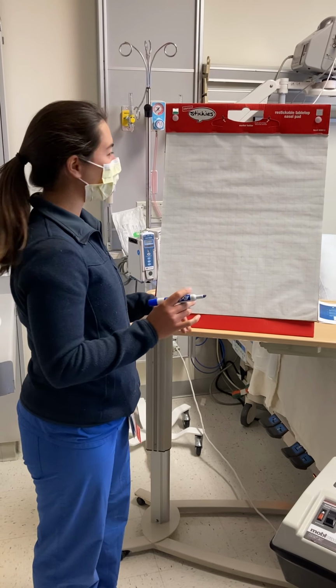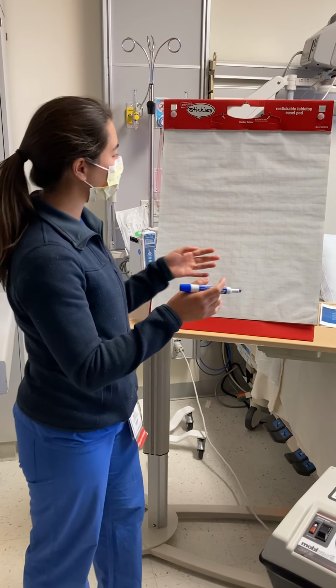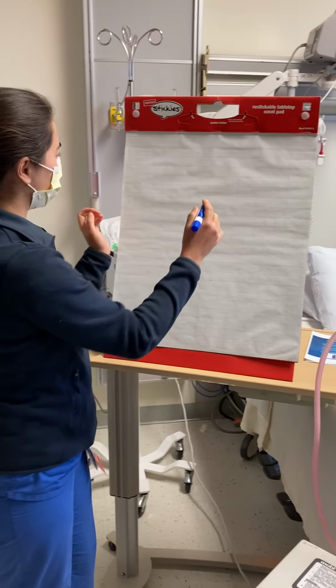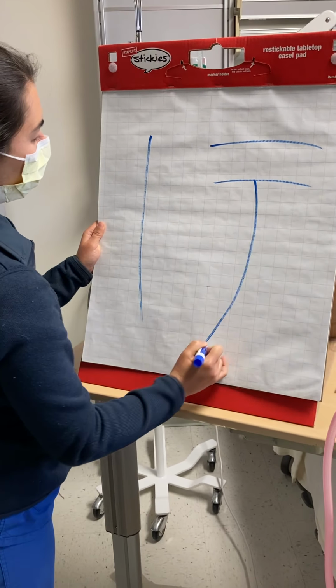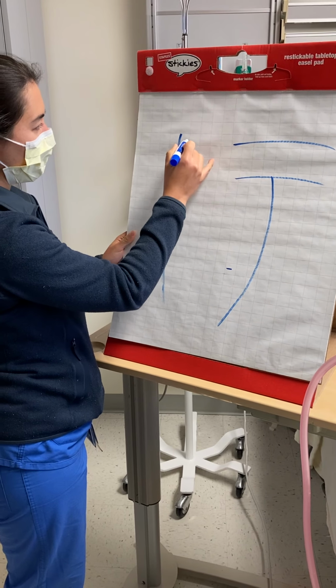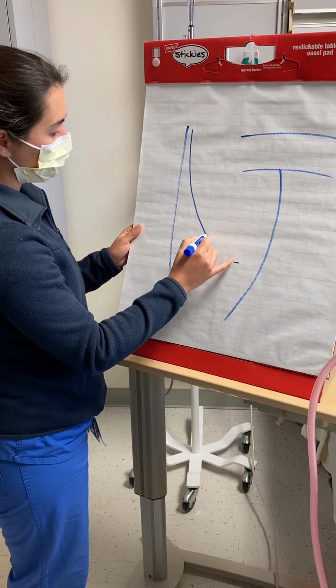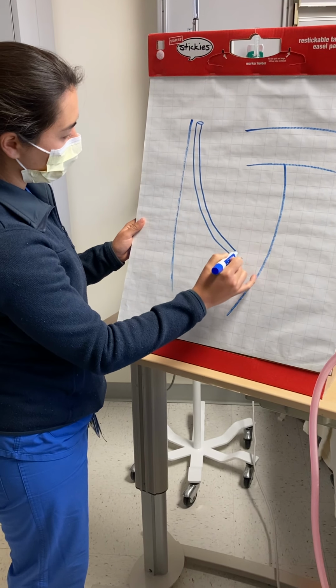All right, so we're going to talk about how to assess the atrium and the chest tube, but first I want to start off showing you where it normally lies. So if you imagine a patient's laying on their side like this, and then here's the arm. Normally you'll see a chest tube coming out of here, and then we like to put it usually apical and posterior so it can catch any of the air that's coming out.